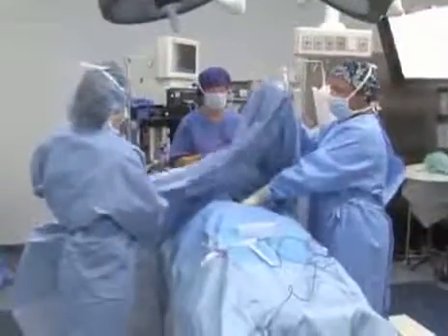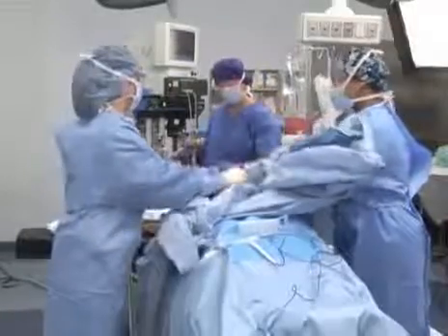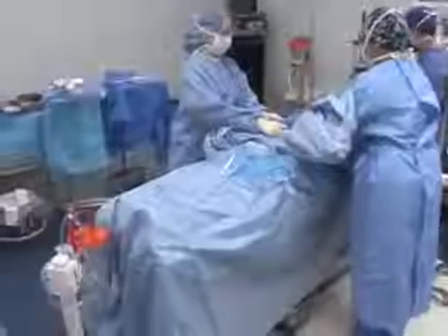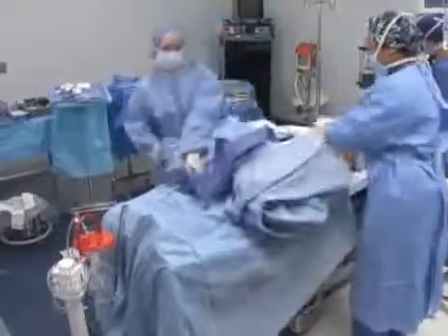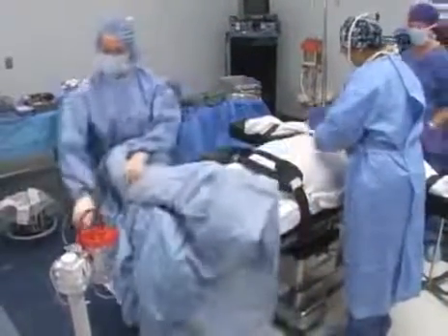One member of the sterile team holds any dressings in place while the drapes are slowly removed. When removing the drapes, pull them away from the patient, starting at the patient's head. Begin rolling them and proceed downward toward the feet. Be careful not to dislodge any wound drains.